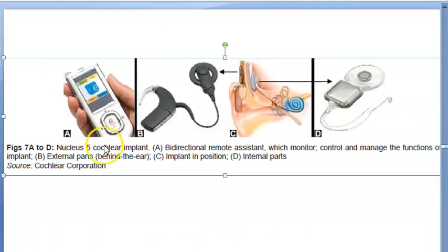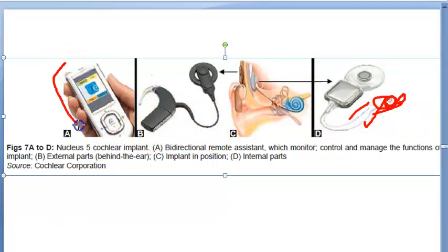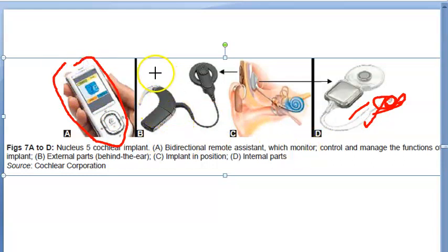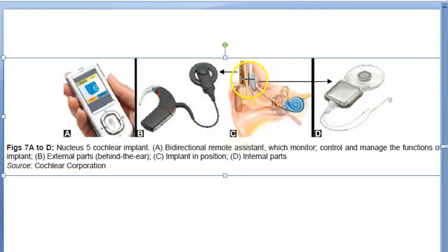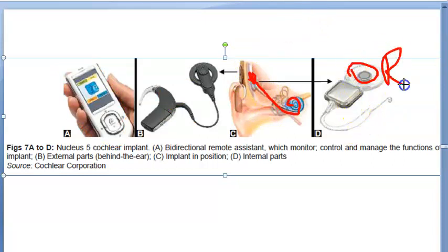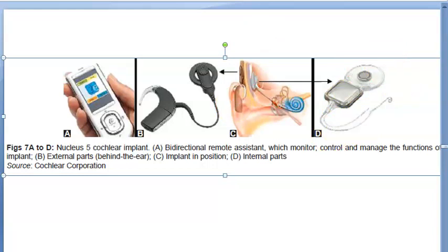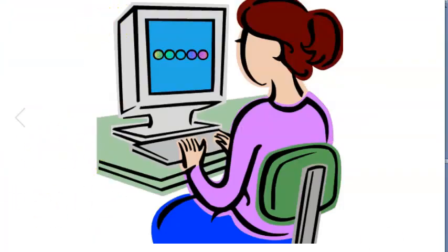The Nucleus 5 cochlear implant - here they are showing the coil. There is a remote control to control the device. Behind the ear they plug it like that, and here you have the implant in position. Here is the internal part with the receiver. With Nucleus there will be a remote also.